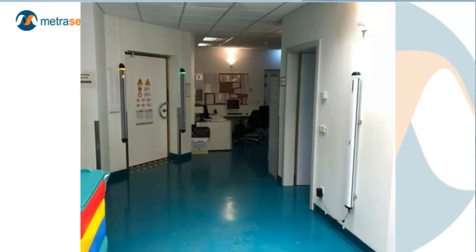Actually, I will show you 2 examples in this slide right here. So on the left-hand side of the photo, you can see an MRI room door. You can see the familiar signage on it. Flanking the door on either side, left and right, are doorway entry protection style ferromagnetic detection systems. On the right-hand side of the image, you see the single white pole mounted on the wall. That's a screener system. I chose this image because it has both systems in a single picture, but this really represents the best practice combination.